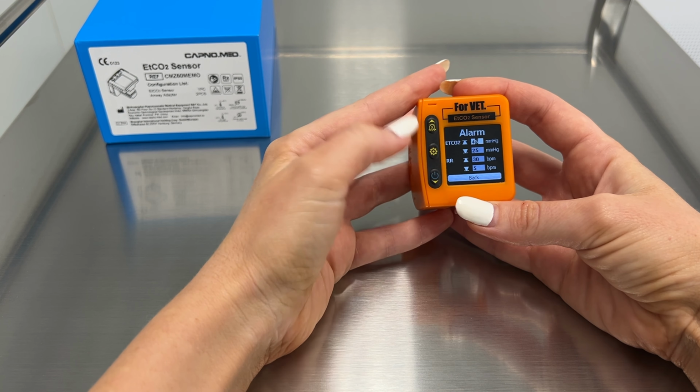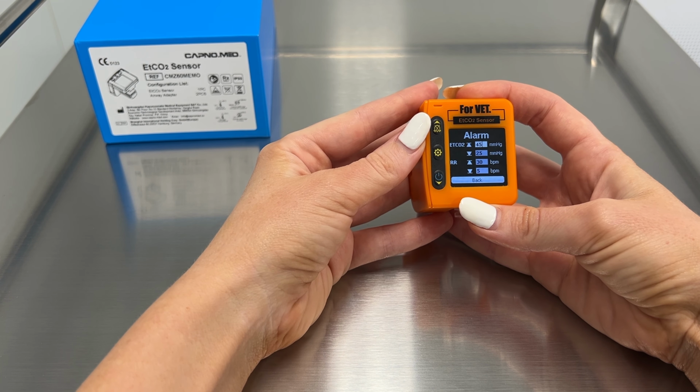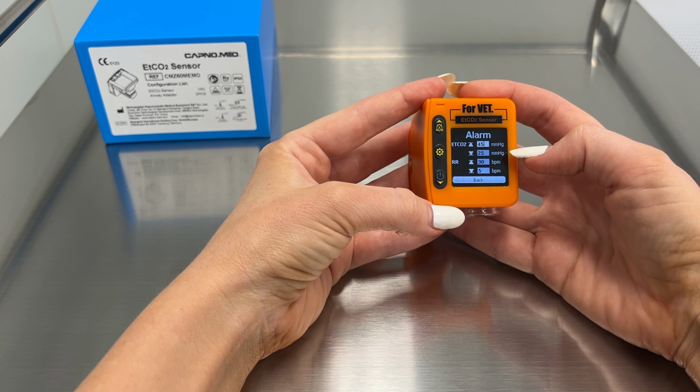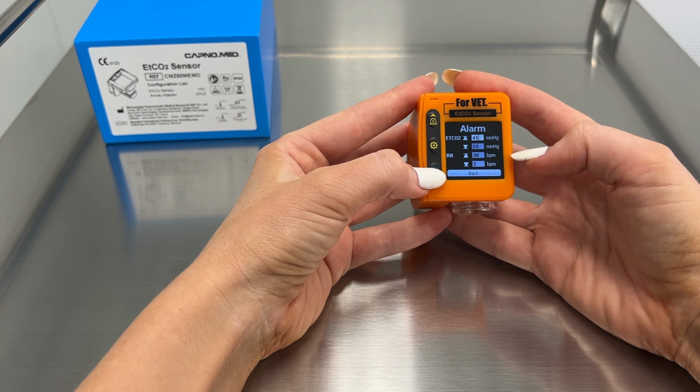To select that as my high parameter, I'm going to press the menu button again, select. And now I just want to increase the low parameter. I want to increase that a little bit as well. So we're going to go down.